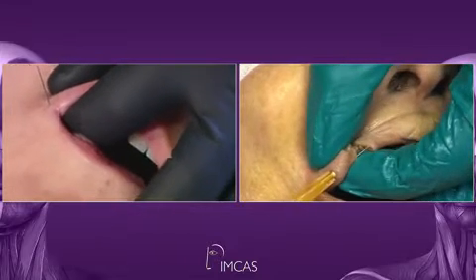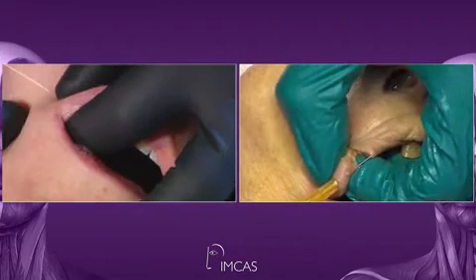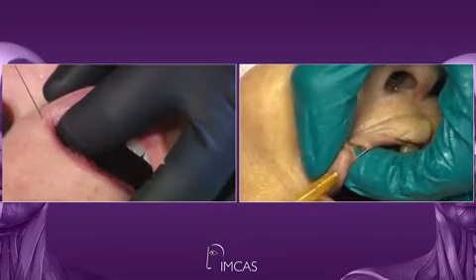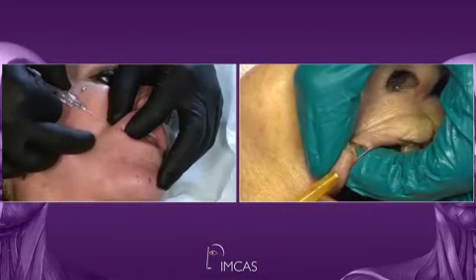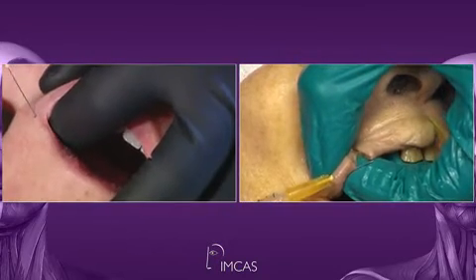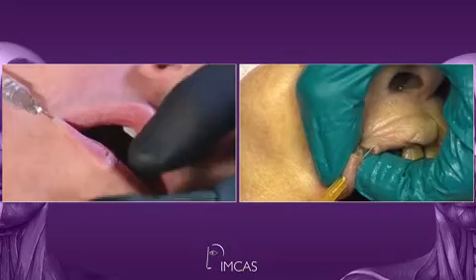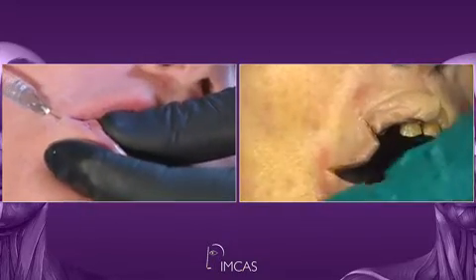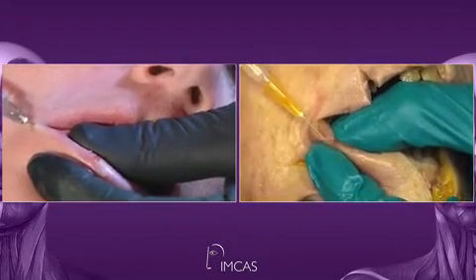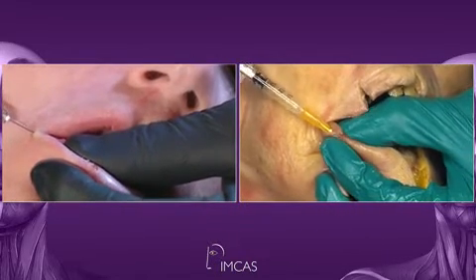And we just were shown the modiolus and the insertion of the DAO. So we have, with our cannula, a small resistance here. Try to go superficial to avoid interfering with the blood vessels, and just all the way down. I respect the midline of the lower lip. I think that volumizing just lateral to the midline gives a nicer result.